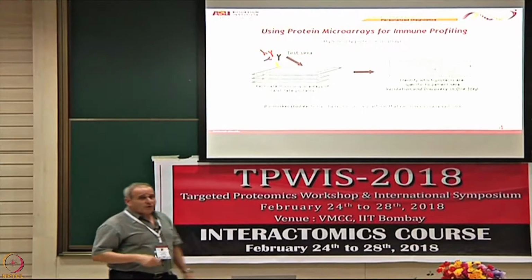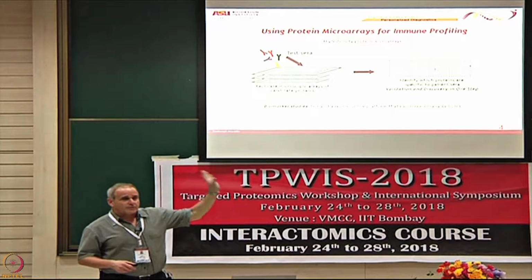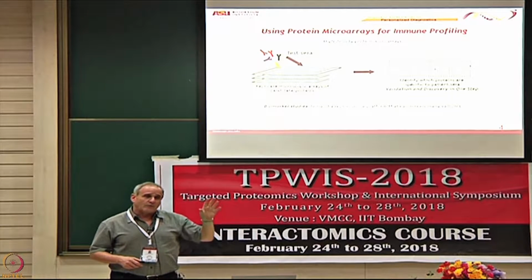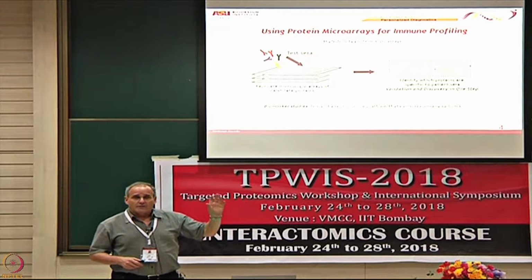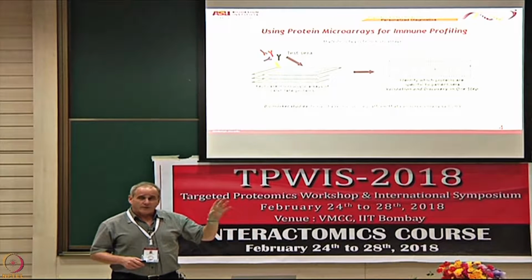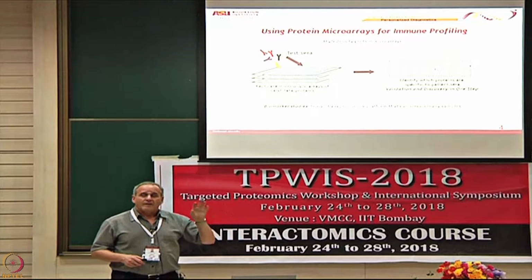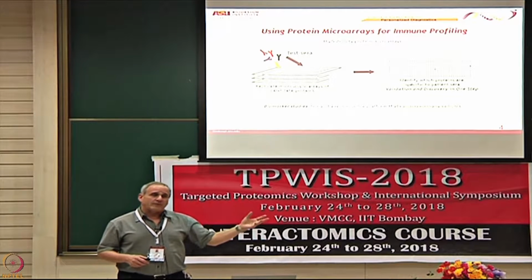For this method to work, you need to know that this protein array platform is reliable. You need to know that when you run it on different days using the same sample, that you're going to get the same answer. Because it's one thing to do research and just hope that it worked pretty well and get some responses that you can then follow up in other studies.